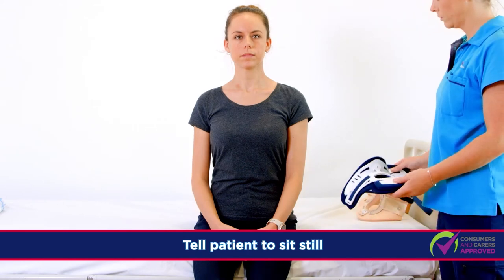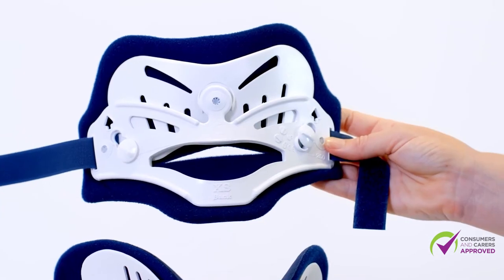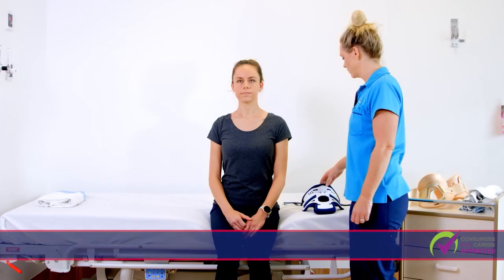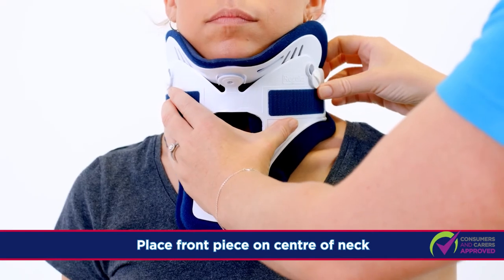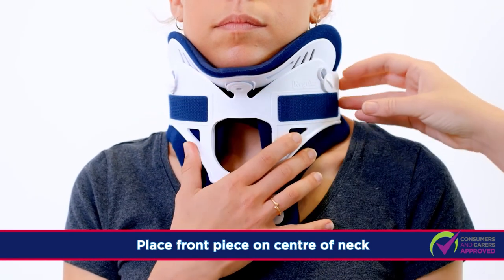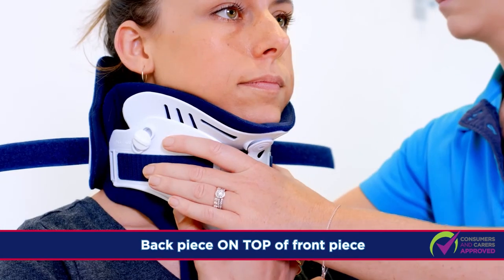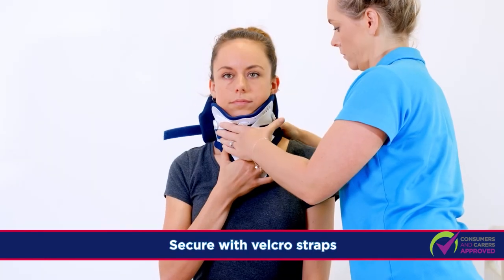The Miami J can also be applied separately. Tell the patient to sit still and not move their head at all times. This is the front piece and this is the back piece. There are labels and arrows for correct direction. Place the front piece of the Miami J collar on the centre of the neck. The patient can help hold the front piece. Place the back piece on the middle of the neck on top of the front piece and secure with Velcro straps.